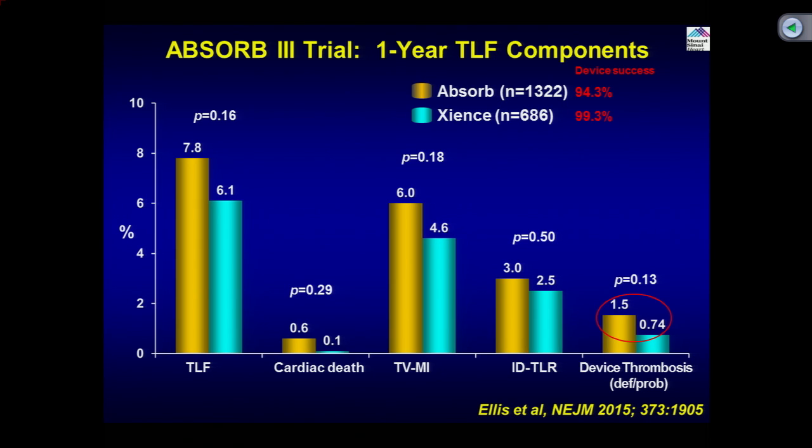So, same shaft delivery system which we have seen now, because we are still part of the Absorb 4 trial, which I'm sure is finishing its completion. And now the GT1 Absorb system, we can definitely feel the difference in the delivery between the two of them, Chuck. Yeah, you can.